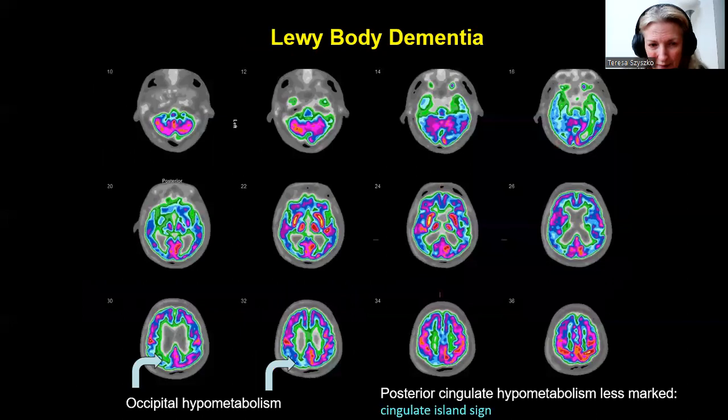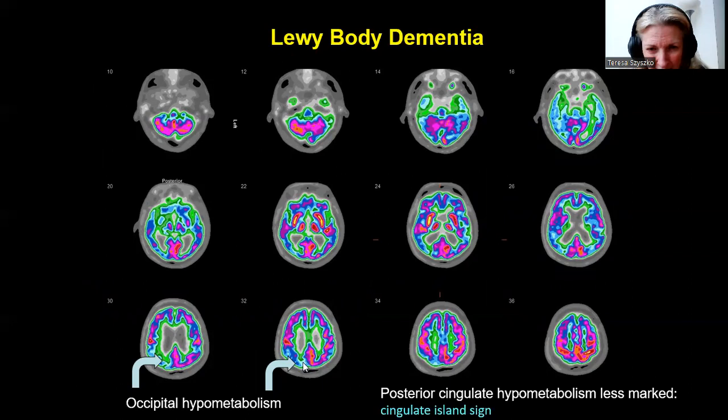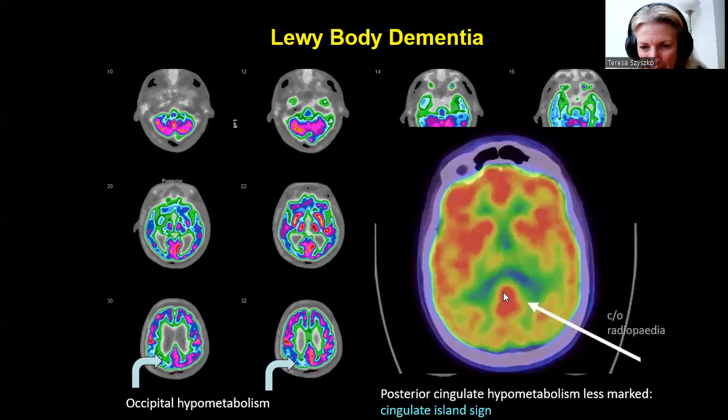Here we have an example of occipital hypometabolism. Systematically, we can see quite a large area — it's relatively asymmetrical — of parietal decreased uptake which extends well into the occipital lobe, and also affects the temporal lobe quite extensively. I want to highlight the posterior cingulate island sign, where you've got quite focal uptake in the cingulate but the hypometabolism is less marked. This occurs with Lewy body dementia.